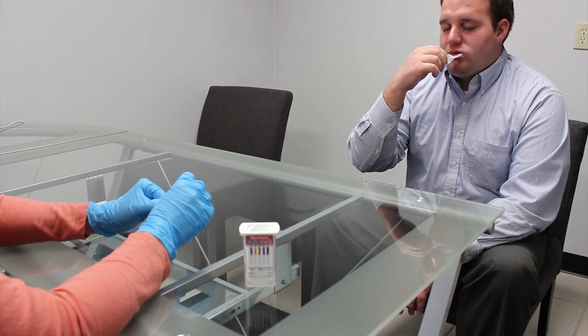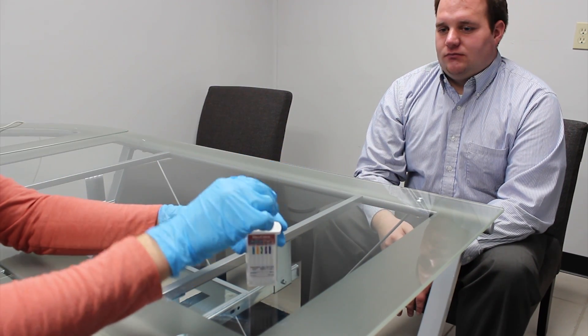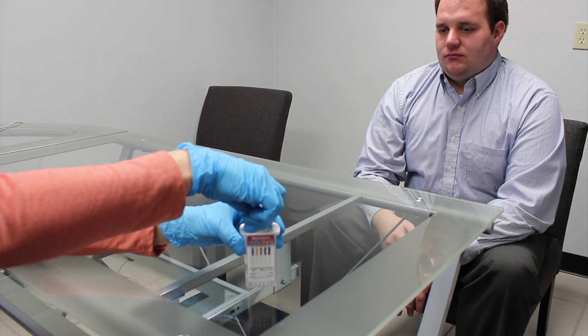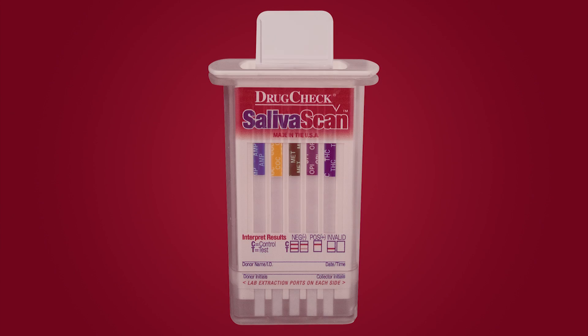Remove the collection swab from the donor's mouth and, without touching the sponge, insert it sponge-first into the screening device, pushing until the locking flange locks in place in the bottom of the device. Once the collection swab locks in place, the device is airtight, tamper-evident, and ready to be disposed of or sent to a laboratory for confirmation for a presumptive positive result.